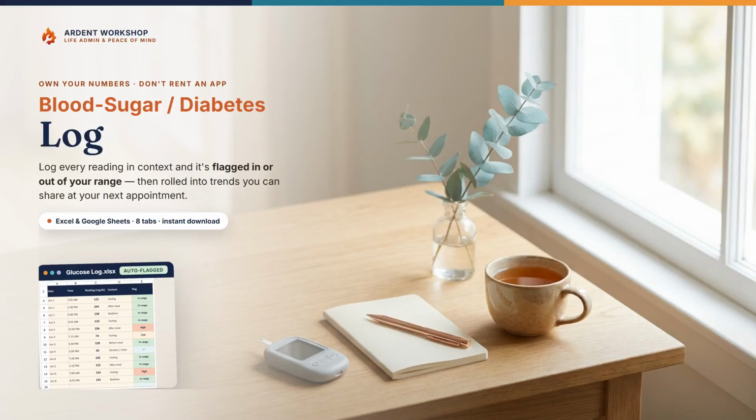Your meter shows you this moment. What it can't show you is the pattern, that your mornings have been creeping up for 2 weeks, or that one particular meal spikes you every time. The blood sugar diabetes log turns a month of readings into trends you can actually see and share.